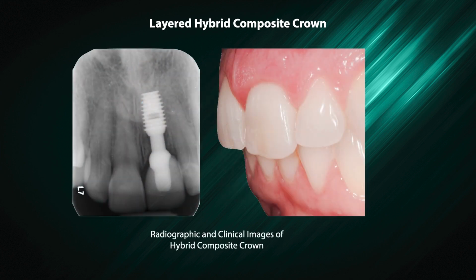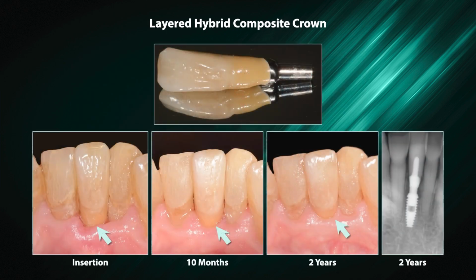Radiographic and clinical images of hybrid composite crown. Layered hybrid composite crown at insertion, 10 months post-insertion and 2 years post-insertion.